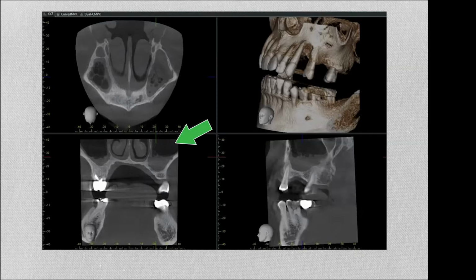I prefer a little bit larger cone like this one, where I've set my cutoff at 9 millimeters. Anything higher than 9 millimeters, I find, and it's not totally arbitrary, the weight of the mucus or mucosal lining will weigh on the implant and push it down, especially if I need to do a sizable, like 3 or 4 millimeter or 5 millimeter sinus lift.